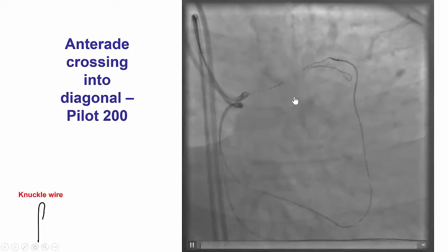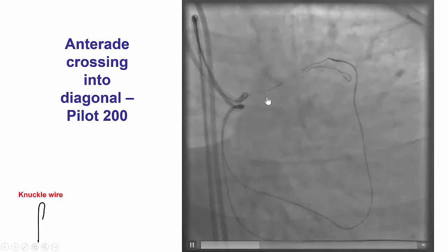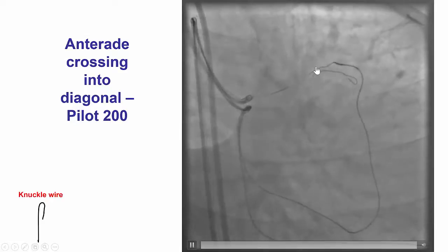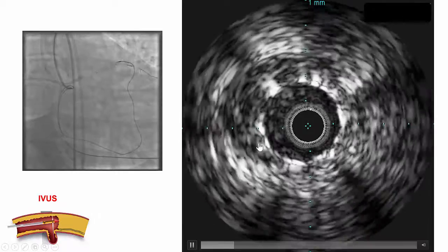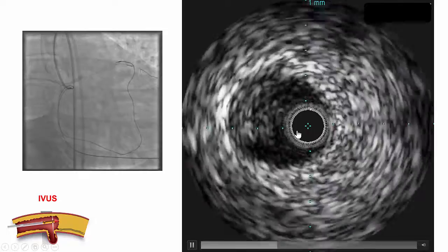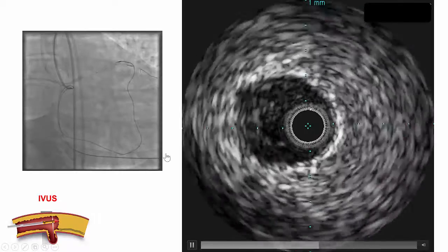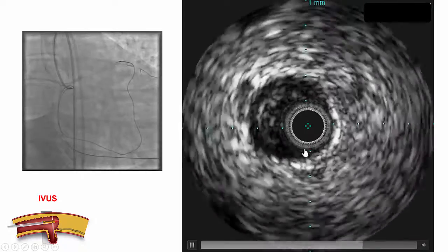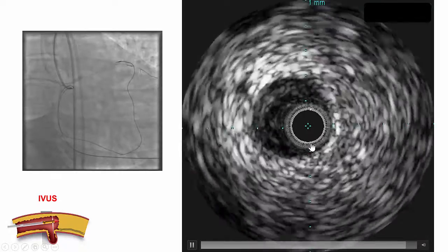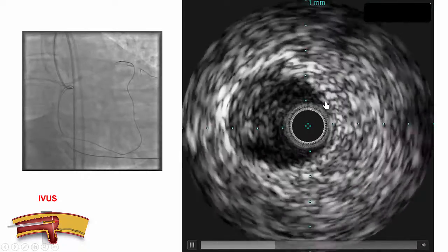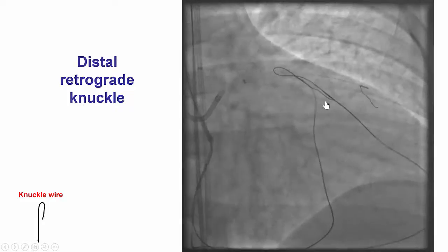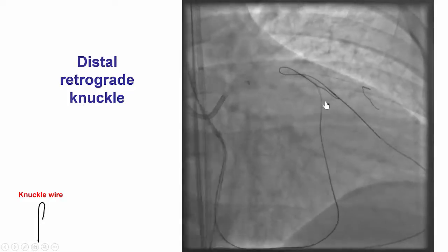After doing that, we were able to advance an antegrade Pilot 200 guidewire that was knuckled, and intravascular ultrasound confirmed that that wire was actually inside the previously placed stent, although more distally it might have been in a dissection plane.